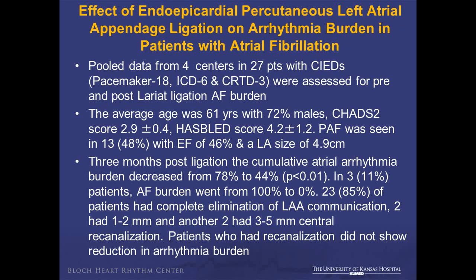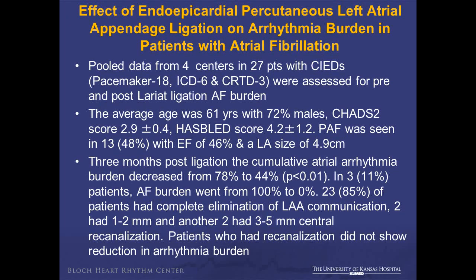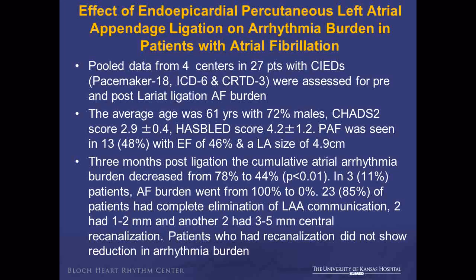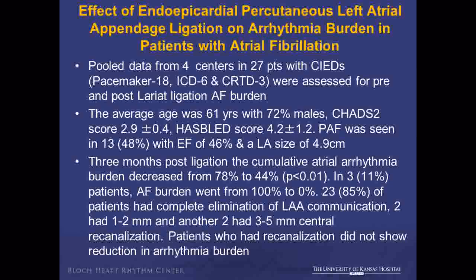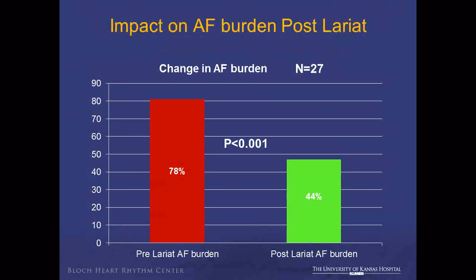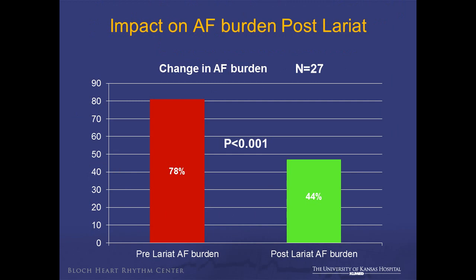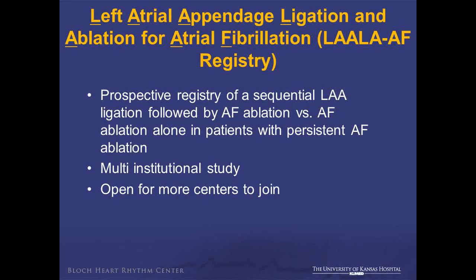So what is the effect of endo-epicardial percutaneous left atrial appendage ligation on arrhythmia burden in patients with AFib ablation? This is prospectively pooled data from 4 centers that we typically collaborate with. We studied about 27 patients who had an implantable device, either a pacemaker or ICD, and then we followed them for about 3 months. And the arrhythmia burden decreased from 78 to 44%, clearly proving that there is some antiarrhythmic benefit here.